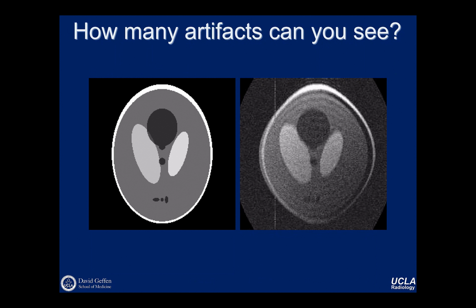I think what you're drawing out is we could have coils in lots of different places, right? We have 8 coils surrounding the object, and so we have these coil elements. When you go to the scanner, you can control the coil elements. We put on a head coil, and we just call it a coil, but the coil has lots of channels. And at the console, you can control which channels are on or off. And there's different reasons you might do that.